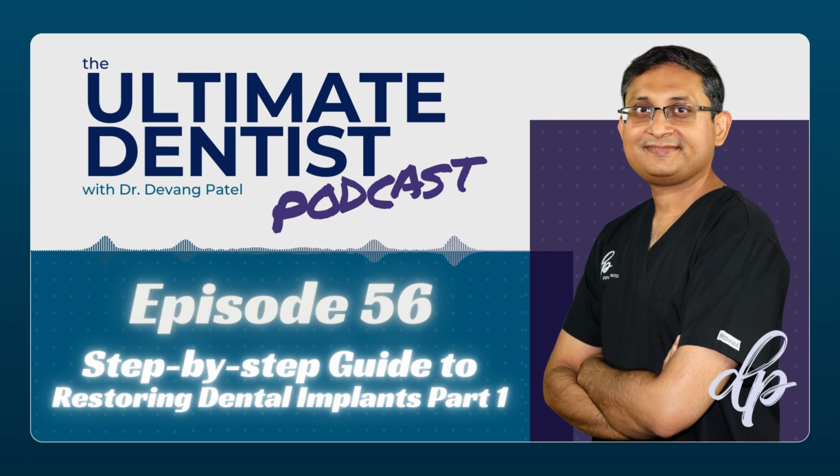Number 7 is restorative space. So make sure that you have enough mesiodistal and interocclusal restorative space for the implant. Number 8 is hard and soft tissue. You may not be able to assess that, and this is where your implant surgeon will be able to help you with a CT scan and clinical assessment, whether the defect is a soft tissue defect or hard tissue defect.